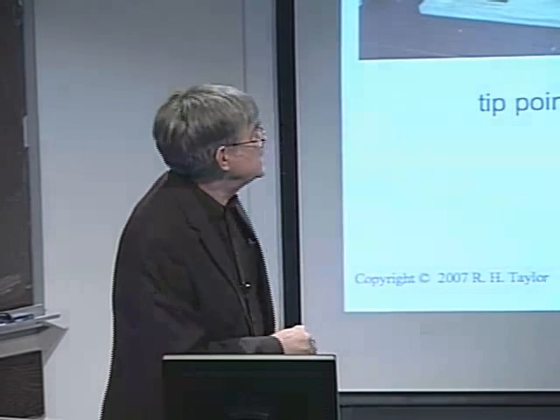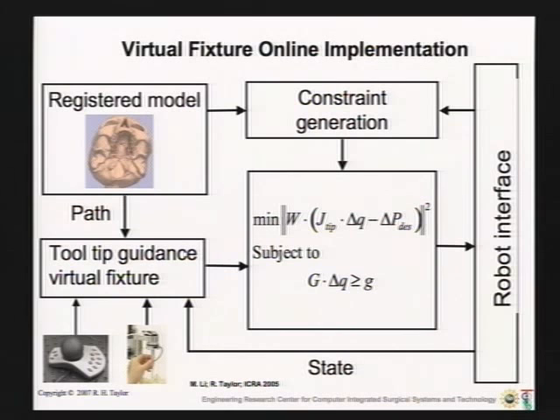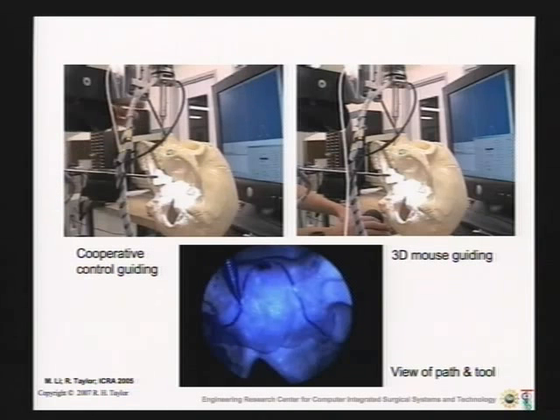And as one example, here, what we're trying to do is move a bent instrument down inside the patient's body without impinging on any constraints. Here we're just using this bone phantom, say you can't touch the bone phantom. In a more real case, you could think of these as brain structures you've identified. And again, we're able to automatically generate the constraints largely using some computer graphics techniques, but basically generate the constraints and go through this whole loop about 200 times a second, which is more than sufficient for this sort of surgical robot control.